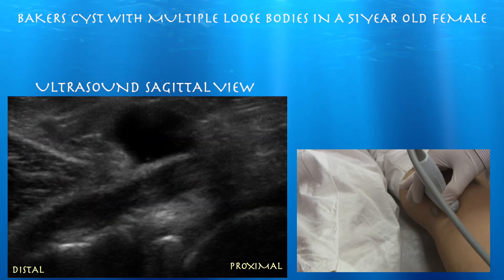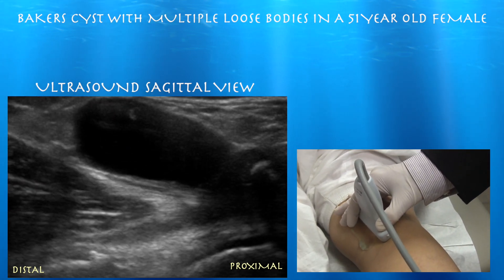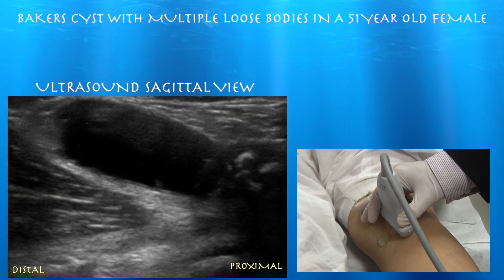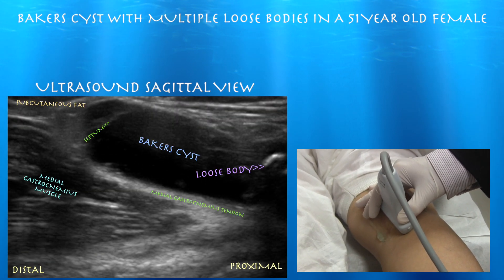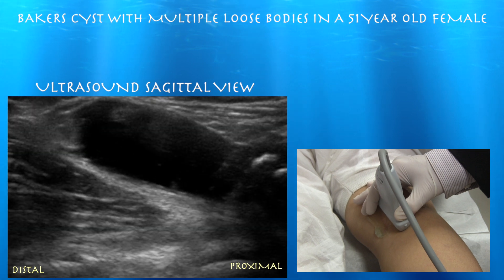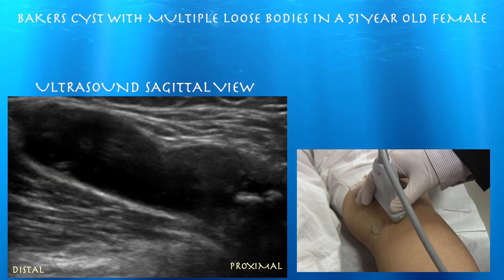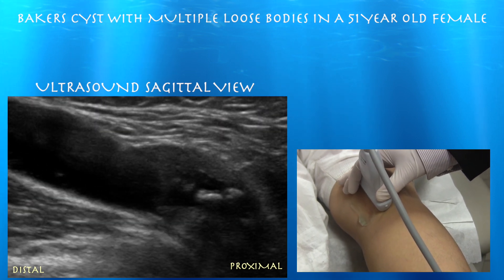You can see that crisscross pattern between the semimembranosus tendon and the medial gastrocnemius tendon. We're going a little bit lateral and we can see that cyst just kind of come into view there. A loose body is proximally in the cyst and septation distally. Now we can see the medial gastrocnemius muscle and tendon going right underneath the cyst.